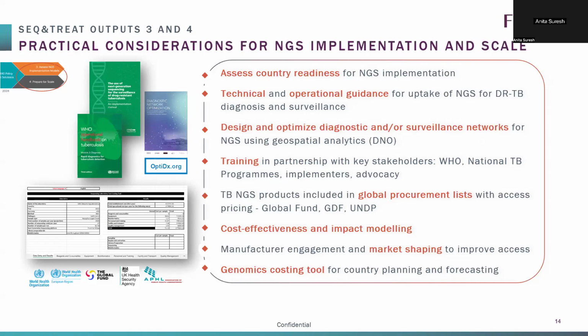And where is it more cost effective to have, say, a fewer number of diagnostic devices, but more samples can go on them. So for sequencing, this is obviously something that makes a lot of sense, especially because it truly can be used not just for TB, for everything else. You don't need 50 or 100 sequencers in a country. You might need the few that you already have to be better utilized and more optimally capacity utilized for more of your priority diseases. So that's another tool we're working on, at least testing it out with Brazil and a couple of other countries that are interested.